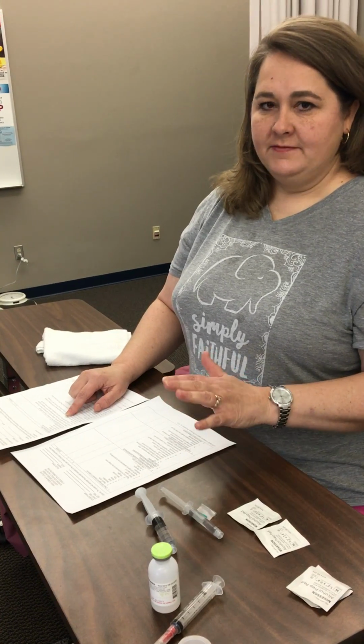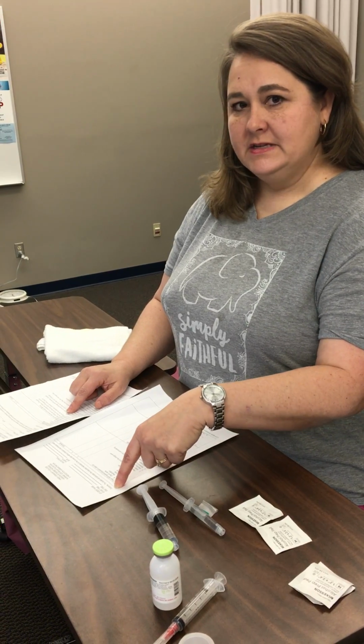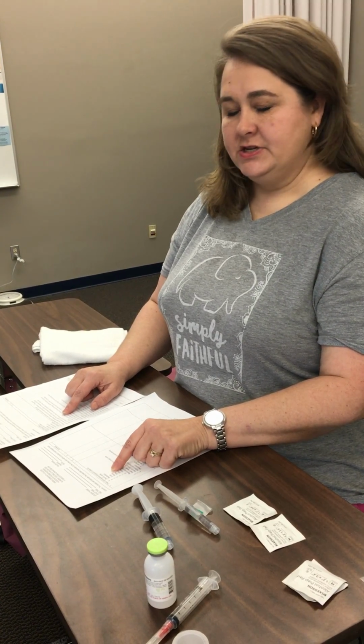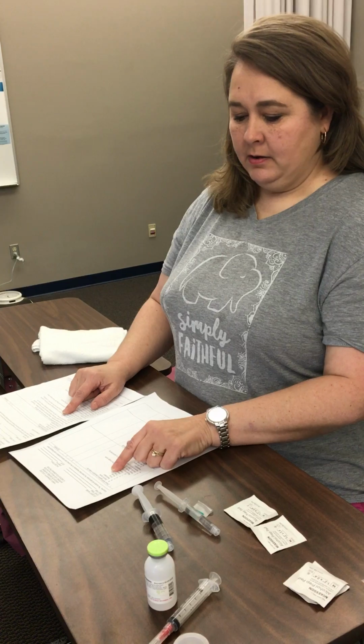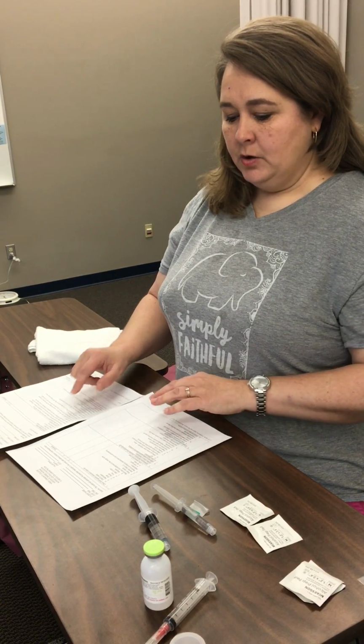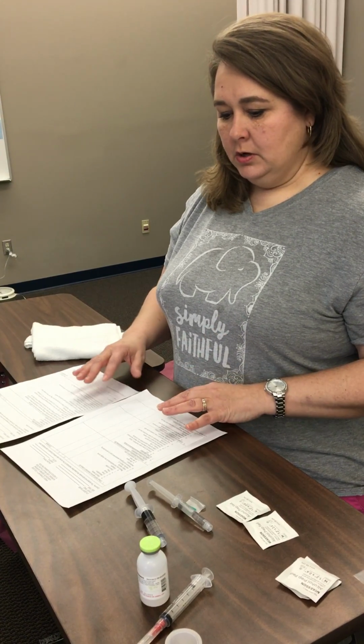The 5 or 7 rights still apply here, so we want to follow these steps with every IV skill that you have. So you want to begin with checking the client's name, make sure you have the correct medication, the right dose, the right route, of course the right time, the date of the order should be the same, and then assess for allergies. Report any inconsistencies that you find to your charge nurse, or in this case it would be your instructor in clinical.